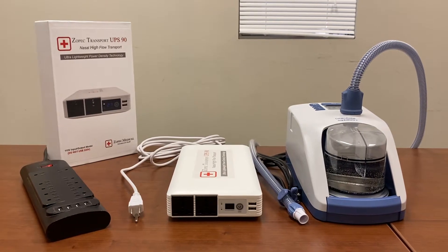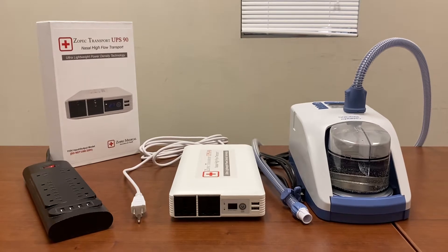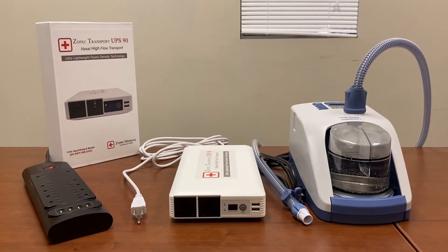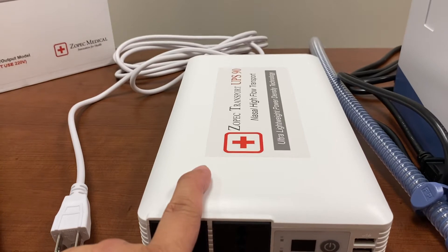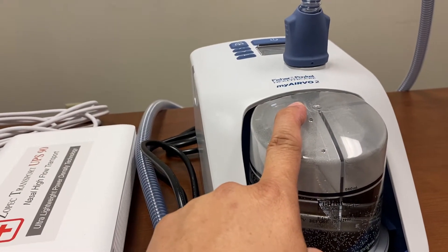Hi, this is Strong from Zopec Medical. This video will demonstrate how to use the Zopec Transport UPS-90 for nasal high flow transport. In front of me I have a power strip, the Zopec Transport UPS-90 battery, and the Fisher & Paykel myAIRVO 2.